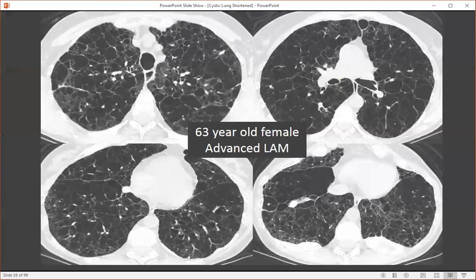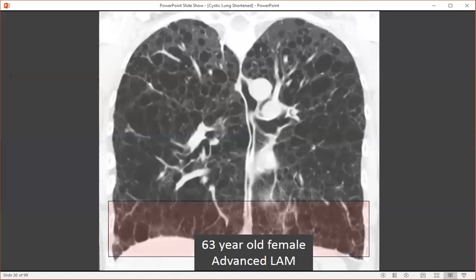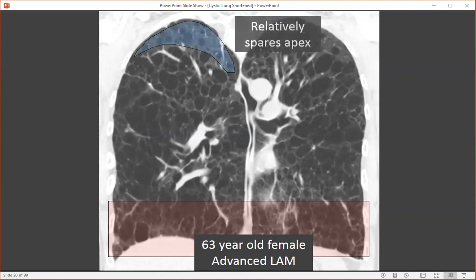Here's a 63-year-old female with advanced lymphangiomyomatosis. Notice that this can be difficult to differentiate from severe centrilobular emphysema. However, most of these cystic spaces have clearly identifiable walls. We can see that the lower lung zones are affected, but the lung apices are relatively spared. This would be unusual for severe centrilobular emphysema, which often affects the lung apices the most.